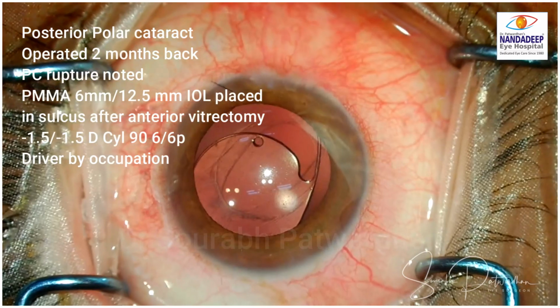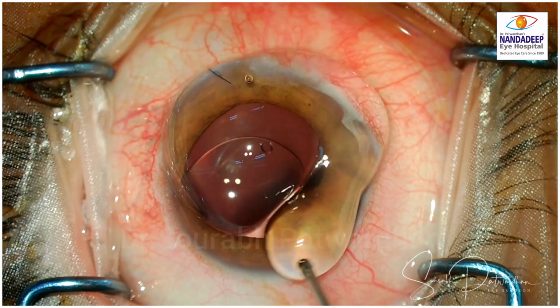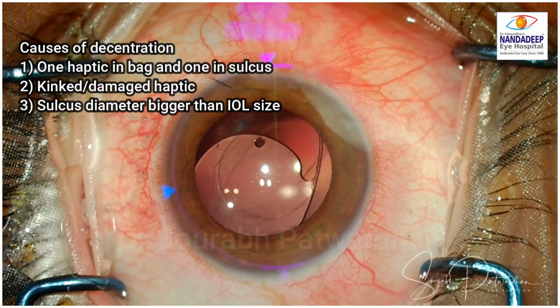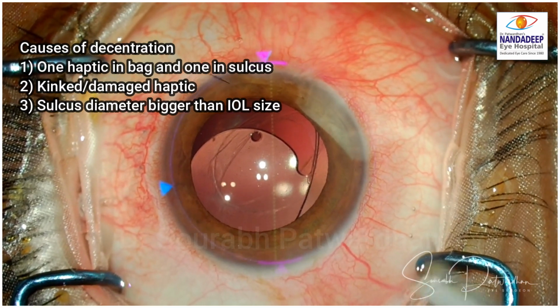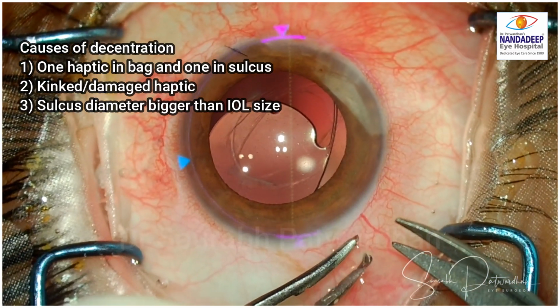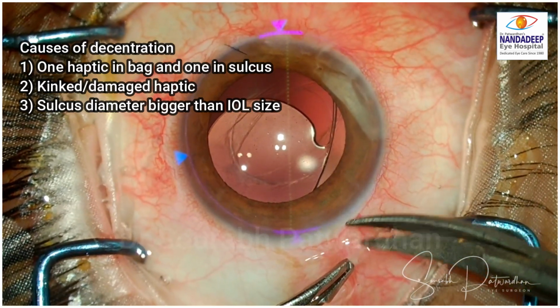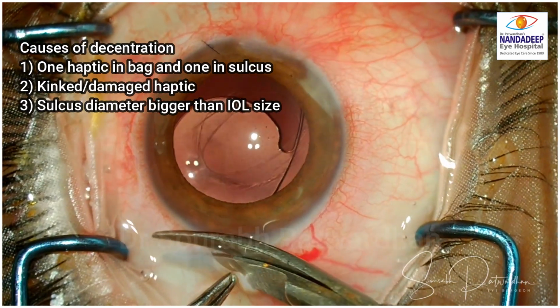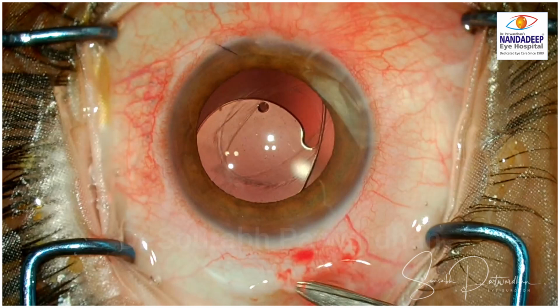Patient was a driver by occupation, so he was having trouble with the glares, as you can see the optic edge is coming in the pupillary area. Now what are the causes of decentration of this IOL? One haptic may be in the bag and the other may be in the sulcus, causing the tilt and decentration. One of the haptics may be kinked or damaged, and the sulcus diameter itself might be bigger than the IOL size. This is a 12.5 mm IOL and the sulcus might be bigger, so that may cause decentration.